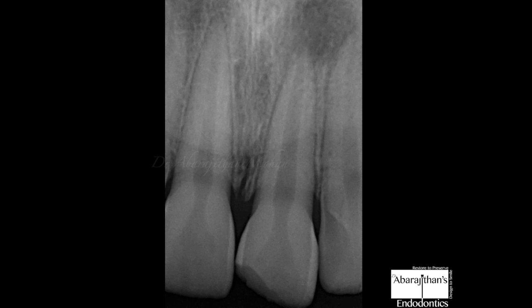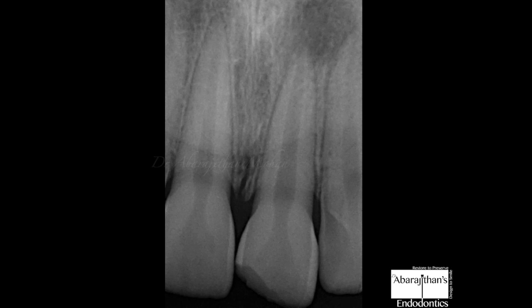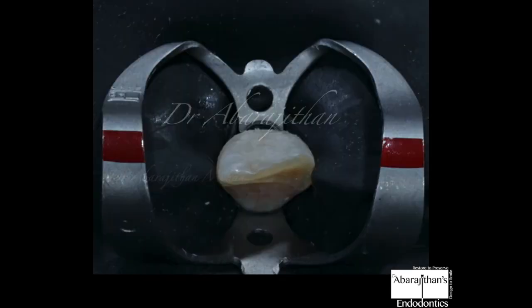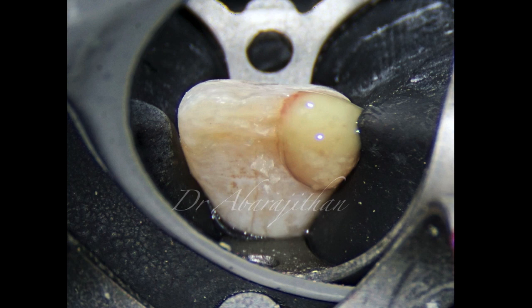The tooth was immature, meaning it had an open apex, so apexification was planned. Generally when you see a tooth with an immature apex, conventional obturation is not going to be enough — we need to promote an apical barrier, which is called apexification. A bioceramic-based apexification procedure was planned. The tooth was isolated, access was initiated through the defect, and after access we could see a lot of pus discharge.